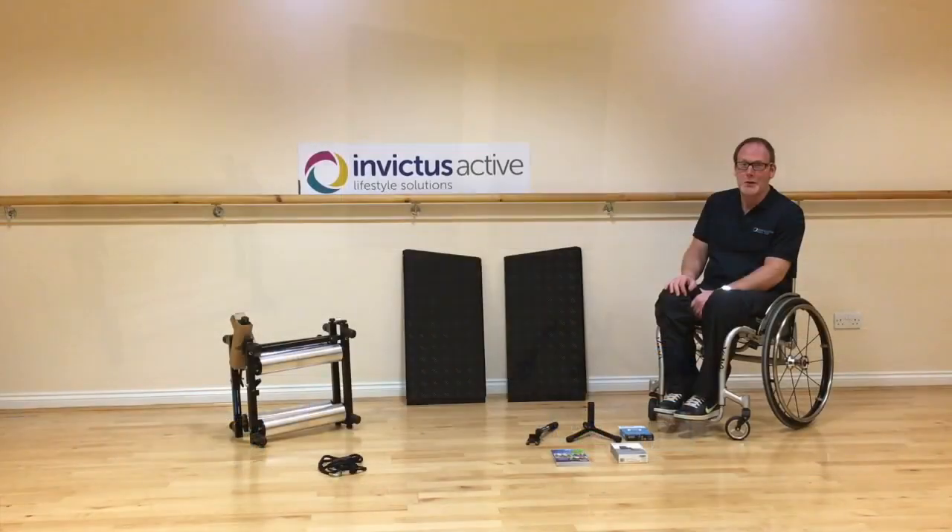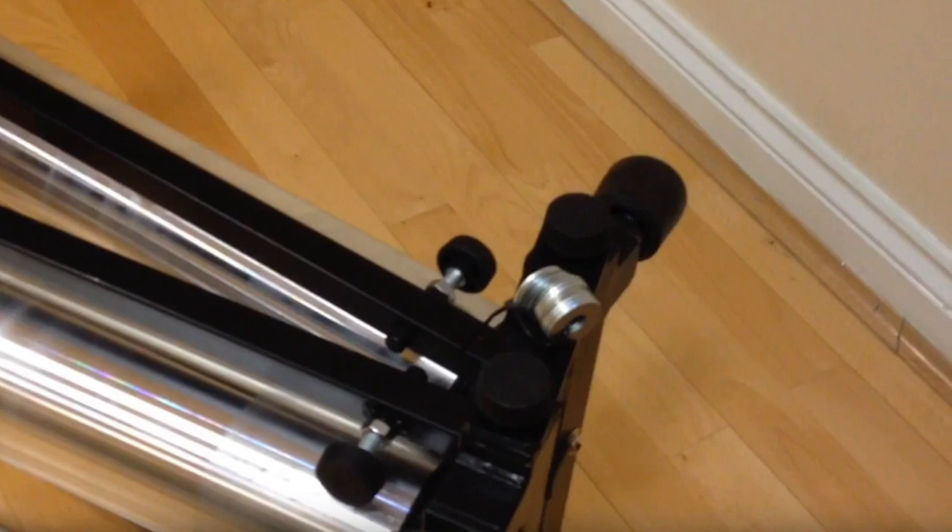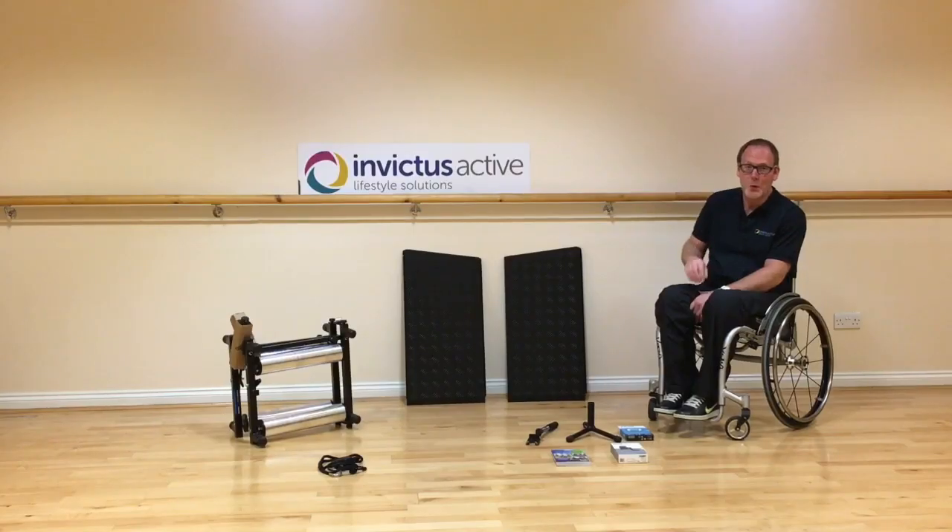When you open the box, you'll find attached to the trainer a set of washers. You need to keep these washers and put them to one side for the moment. We have a separate video that explains how these washers are used to adjust your camber and also to adjust any problems with wheelchair travel. In addition to this video, if you visit our website, you'll also find written instructions you can follow.